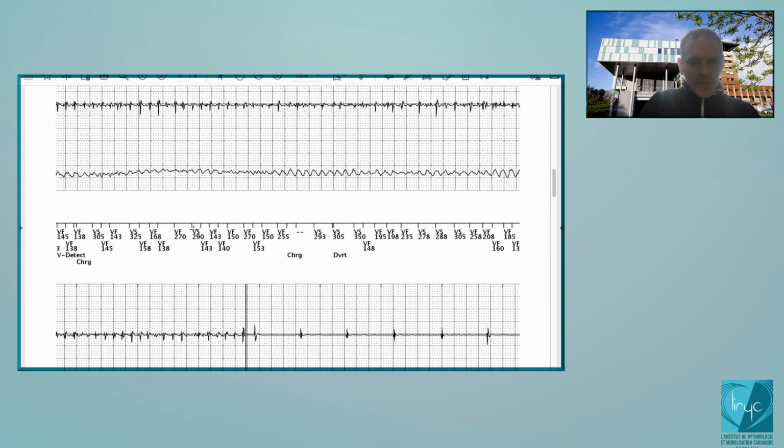So you understand that there is a huge fragility. If, for example, here there is 1 VS, or here VS, or here VS, if you always have at least 6 out of 10, no impact on the charge of the capacitors. But if there is undersensing at this specific time, you are just unlucky at this time. At the end of the charge, there are 2 consecutive cycles and even 3 with undersensing, and then you will divert the charge.